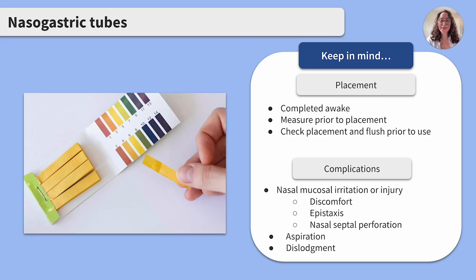The last complication that can arise is the NG tube becoming dislodged. This can happen accidentally if it isn't secured properly or if the client removes it themselves. Speaking as a prior NICU nurse, babies removed their NGs constantly. So be sure the NG tube is at the correct measurement before using it. When the tube is removed, this inadvertently delays and interrupts administration of feeding, medication administration, and gastric decompression, which can all result in complications for the client if it isn't caught and resolved quickly.